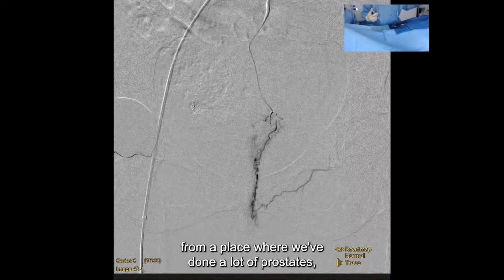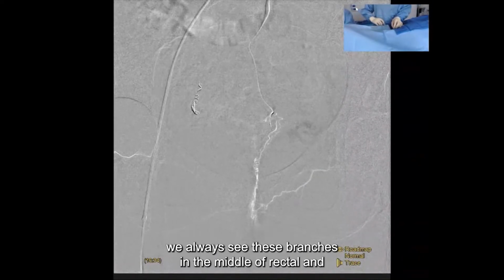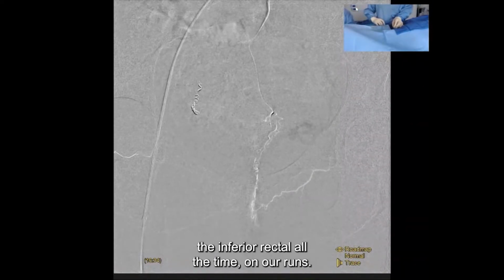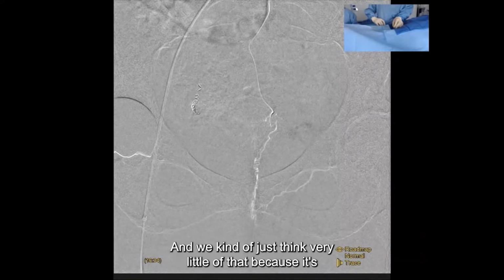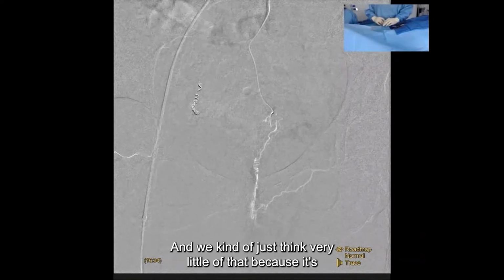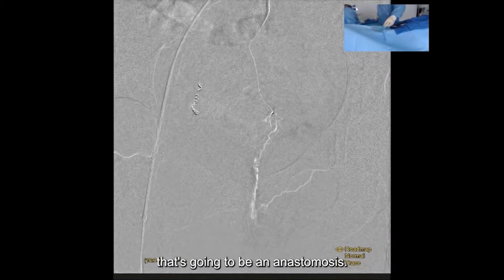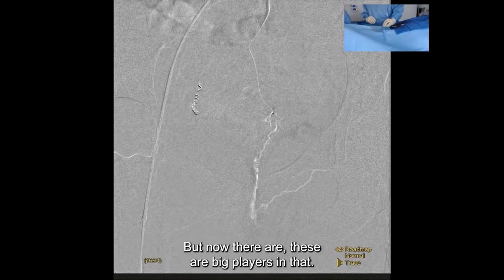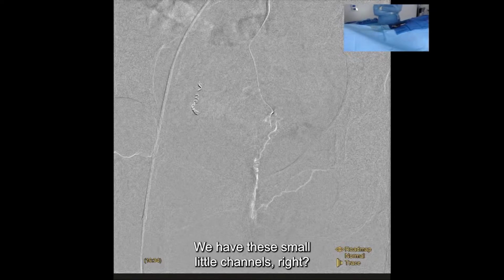It's interesting from a place where we've done a lot of prostates. We always see these branches, the middle rectal, the inferior rectal, all the time on our runs, and we kind of just think very little of them. Because it's prostate, you don't care about it unless it's in your way and it's going to be an anastomosis. But now these are big players. Yeah, you're exactly right. It's funny, these small little channels, right?